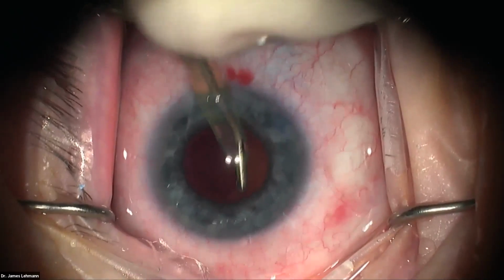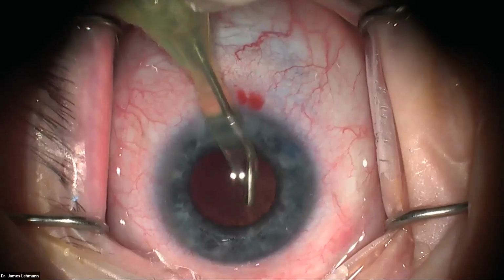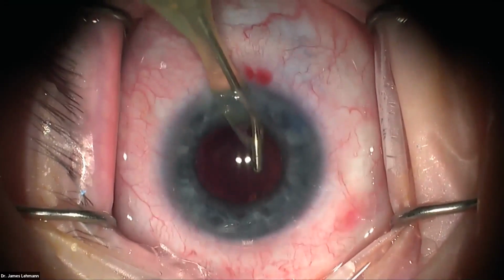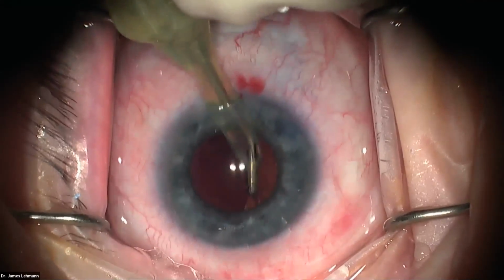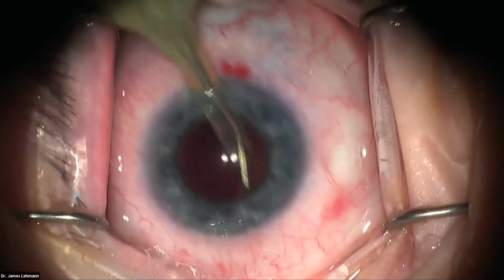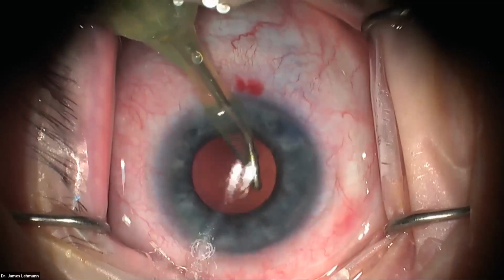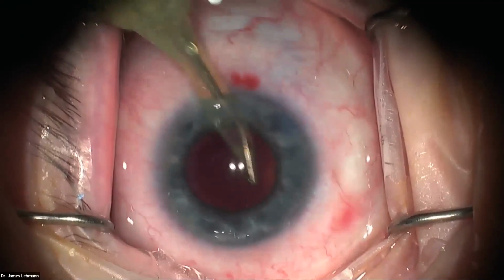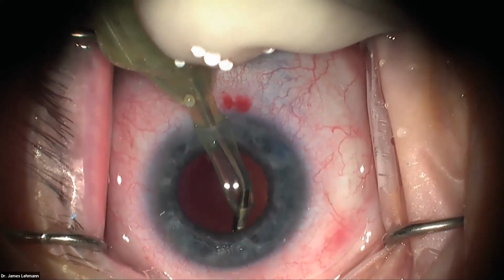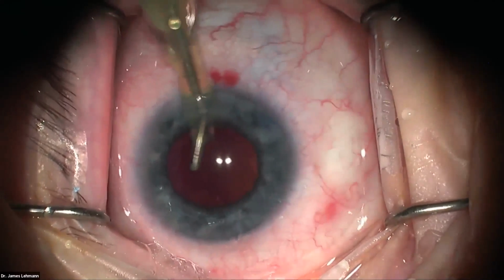And then I'm going to go into that polish mode like Dr. Turok was saying and get all that stuff right there. And now I'm kind of lifting it up, and now I'm going to go back into cortex. Now that it's freely separated from the capsule, I can kind of be a little more aggressive with the cortex mode and kind of bring it to the middle and eat it here. You wouldn't want to go just freely and start sucking with cortex. So again, little polish mode here. And get some of those little fibers there. But most of that stuff can mostly stay.